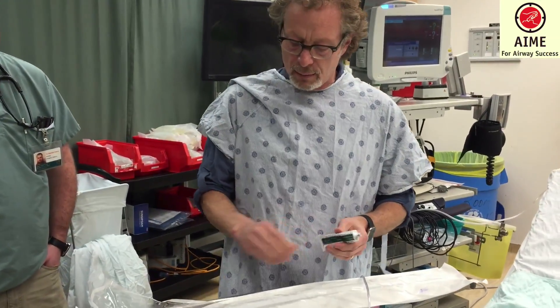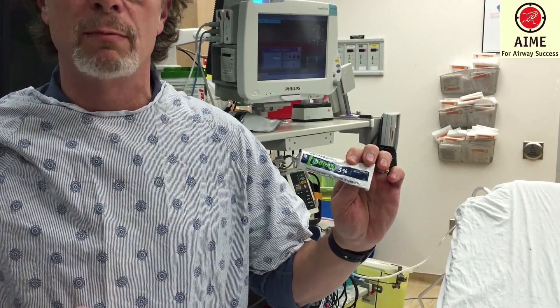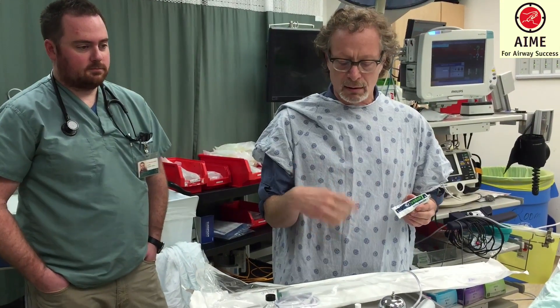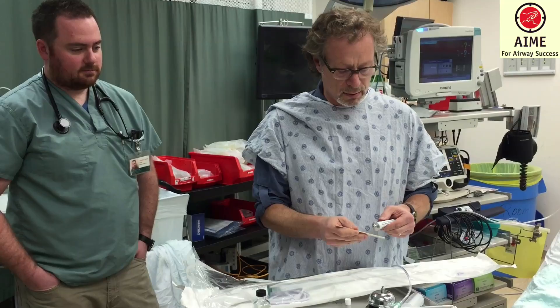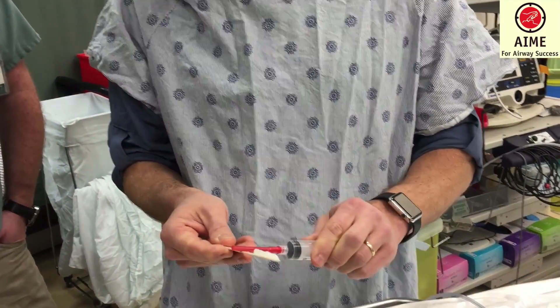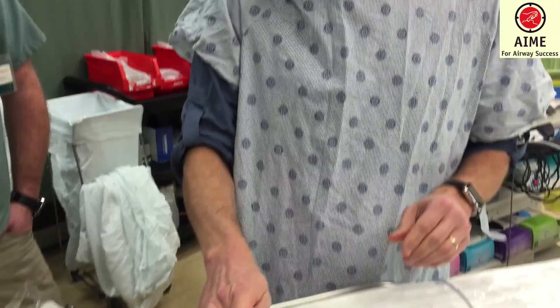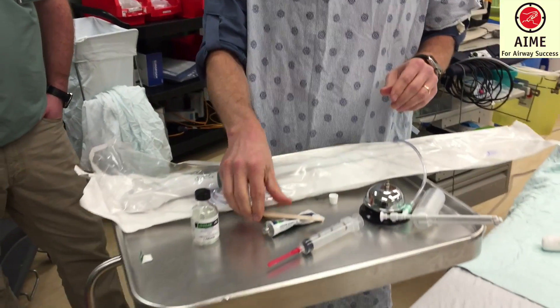The next tool — and even more critical — is a 5% ointment. Not a 2% gel, but a 5% ointment. You can use about three or four centimeters of this in two applications to get the most sensitive area. The most sensitive area is the posterior aspect of the tongue, where you'll have the pressure of the scope or the blade. This is done in a directed manner with a couple of applications on a tongue depressor — sort of a lollipop approach. We want to make it as simple and as effective as possible.